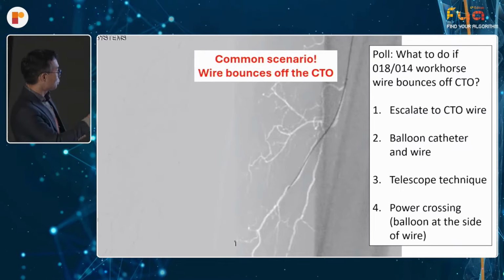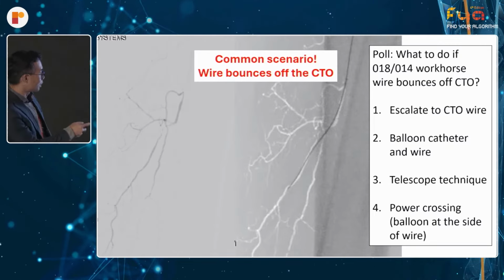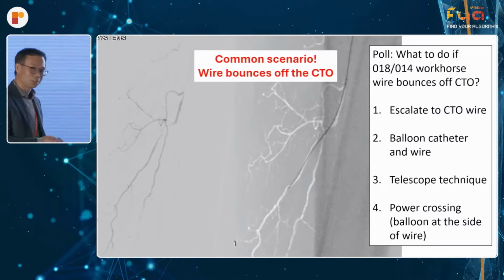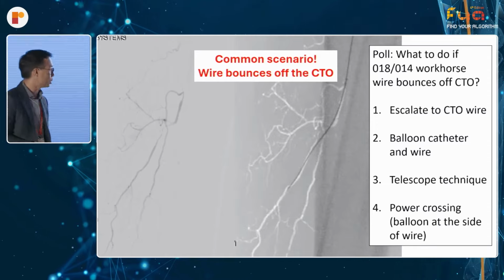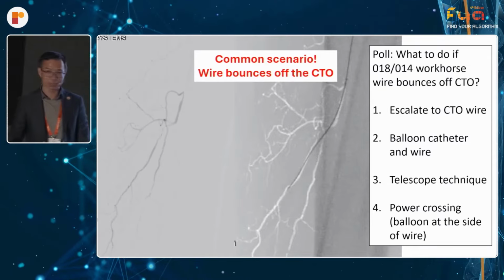A lot of the CTOs will have collaterals coming off it, and very frequently your wire will then sail into the collateral and refuse to engage. So the first poll is, if this were to happen, and this is a very common scenario, what to do if your workhorse wire, either 014 or 018, bounces off the CTO and you can't get it to engage. And we listened to a fantastic talk by Daniel earlier on.